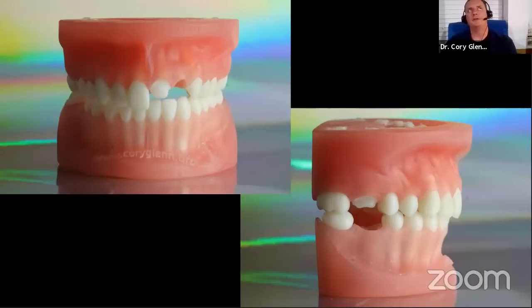I'm not sure if what's meant by that is the ability to pull in and stitch models to a different bite. So for example, if you wanted to do a wax up at an increased vertical, I'd actually do that in the intraoral scanner. I'd prop them open to the right VDO, capture a buccal bite. And then, yeah, absolutely, you can stitch the models to that new opened vertical within Blue Sky.